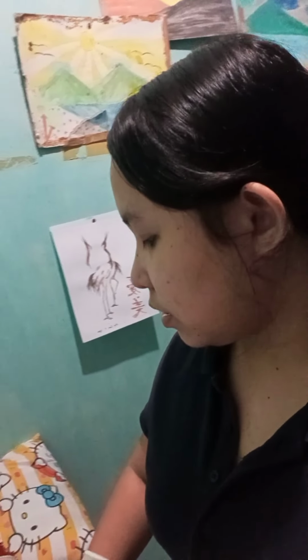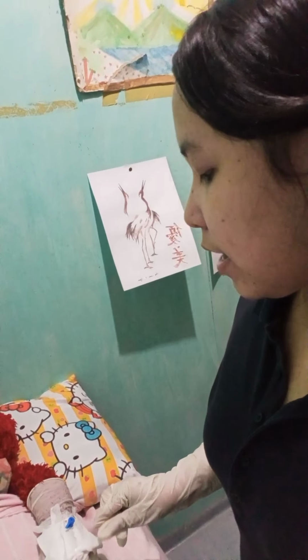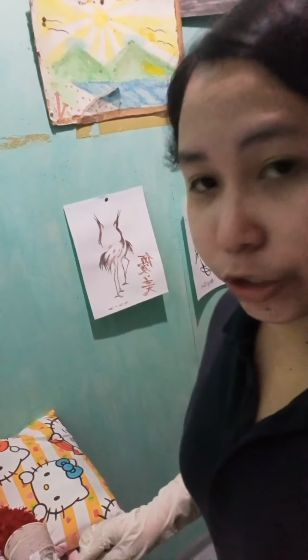After that, position your client in a comfortable position. Then, instruct them to limit their movement to avoid injury and pain. Then, instruct your client not to remove the needle without the doctor's order.